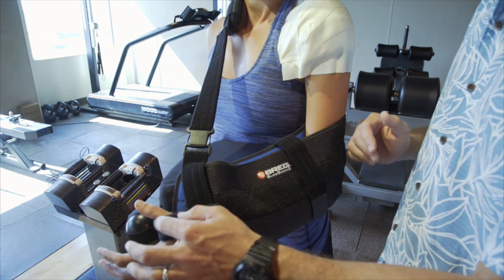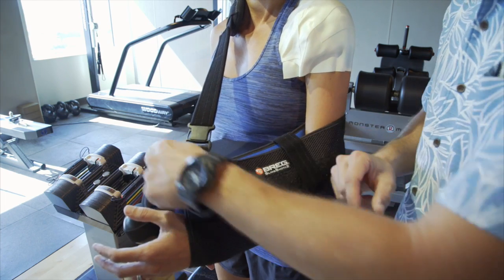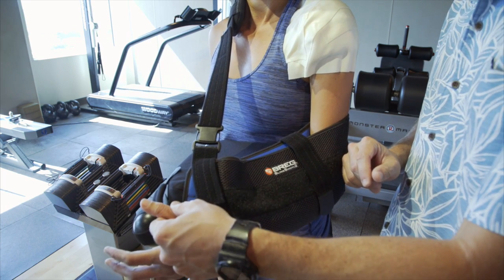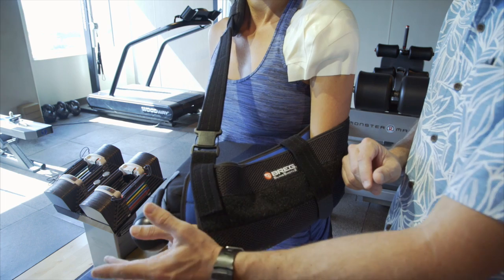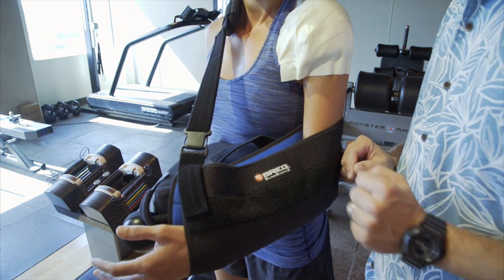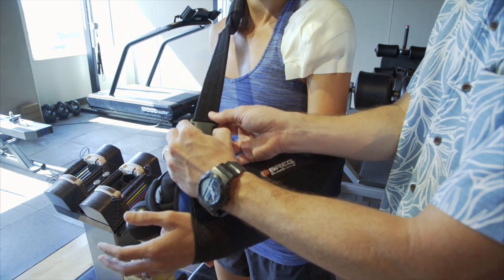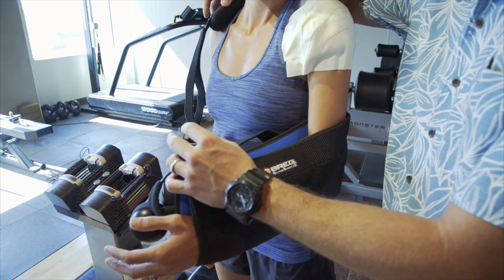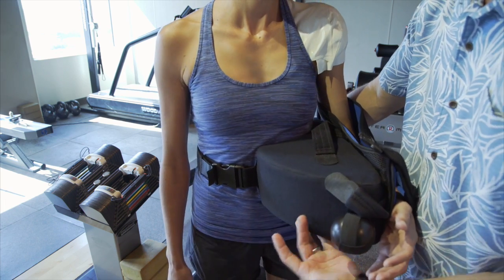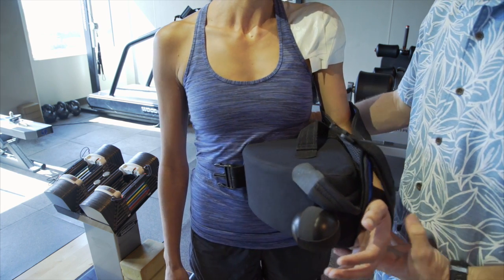If you do have the strap around your thumb — which isn't required — go ahead and take that off. You'll probably wake up with that on there. I don't like to put it there a lot of times because people can get some irritation when they have their nerve block and their hand is numb. Go ahead and unbuckle the main strap, at which point the back strap can come off. Turn around and unbuckle the waist strap, and this will undo the entire brace.